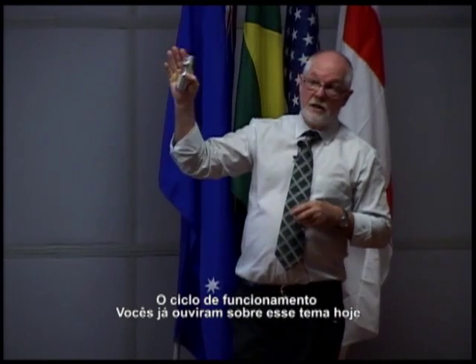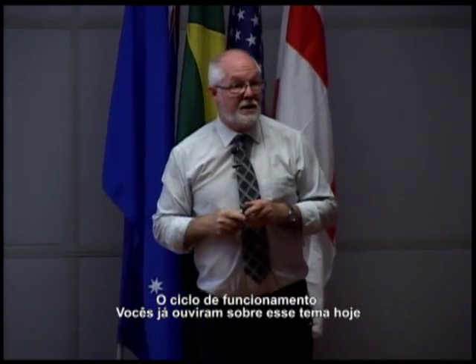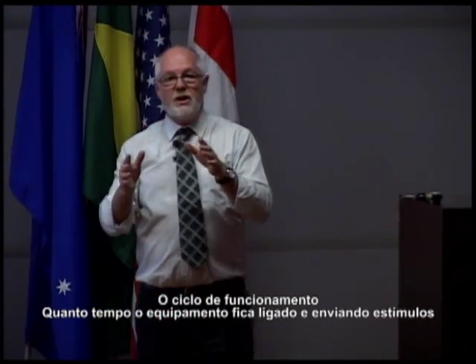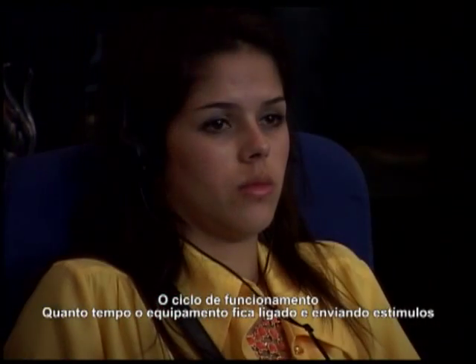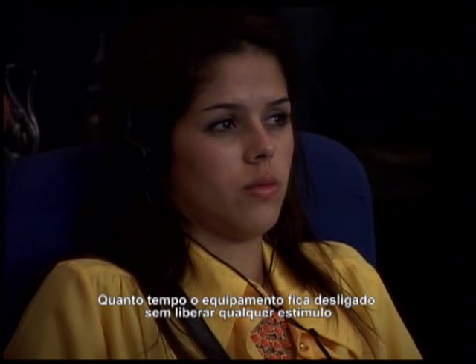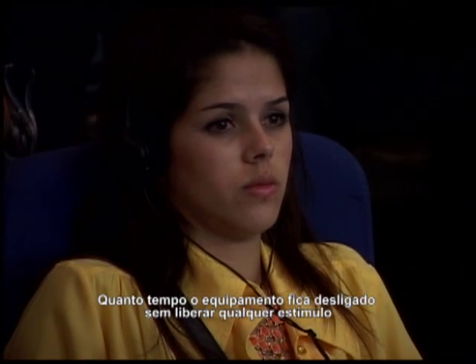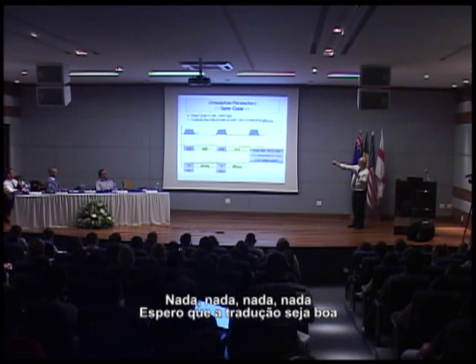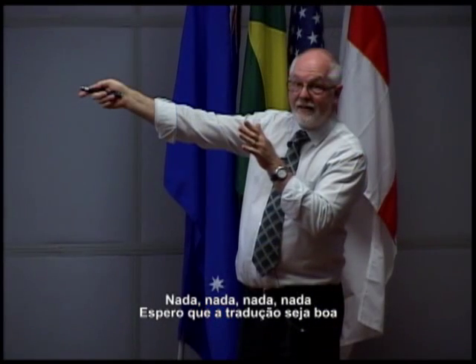The duty cycle, you've heard about it already today. The duty cycle is how much of the time the machine is on and stimulating, and how much of the time the machine is off and delivering no stimulation. So on my picture here, my stimulation comes on, then nothing, nothing, nothing, nothing, nothing. Here it comes again, and the rest, nothing, nothing, nothing.